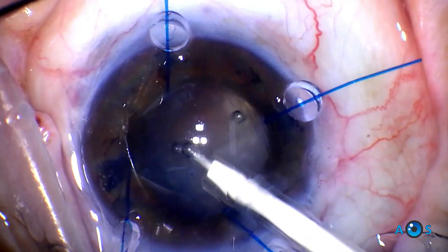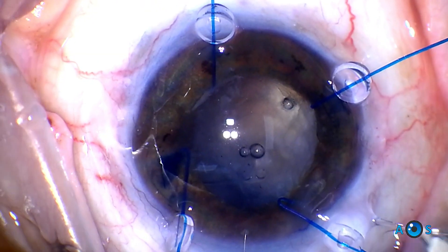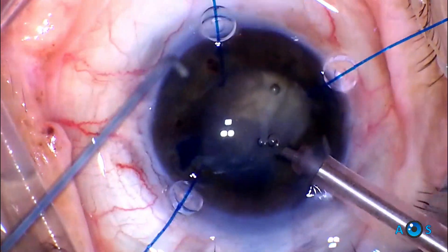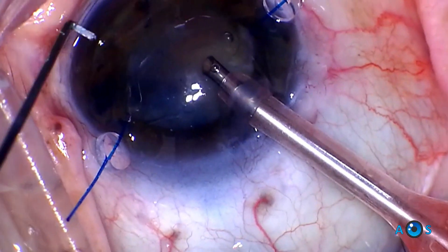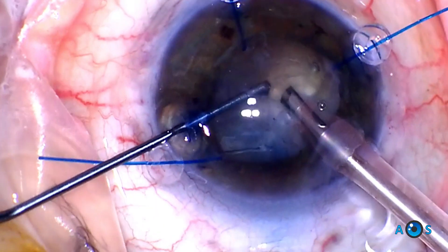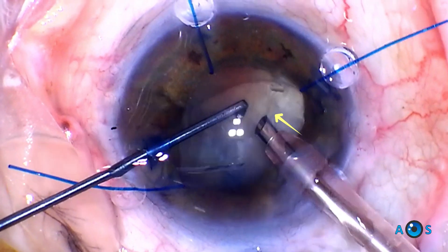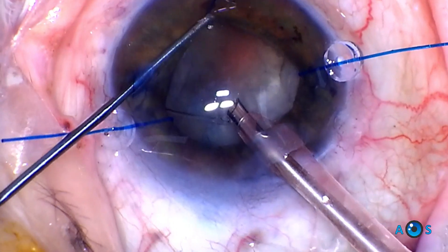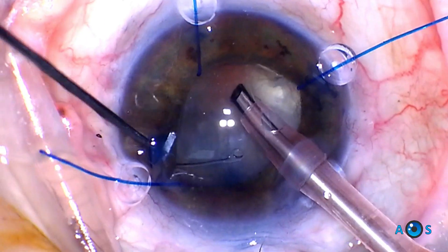However, the trailing end is not in an ideal position. Nevertheless, the cataract is stable and centered, so we now advance to the phaco step. The phaco handpiece is introduced and cortical aspiration begins, however we can easily see progressive downward tilting of this very dense cataract. This suggests that either the zonular dialysis is too extensive or some capsular tearing happened perhaps while inserting the CTR. It is now clear that phaco will not be possible.